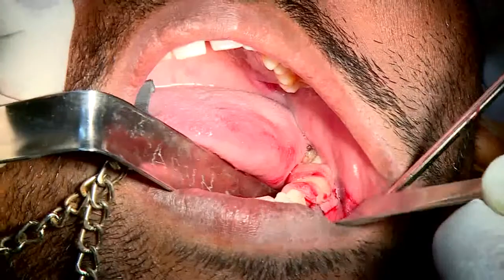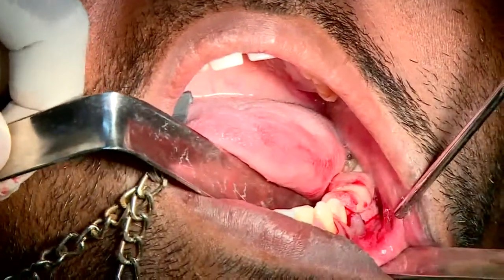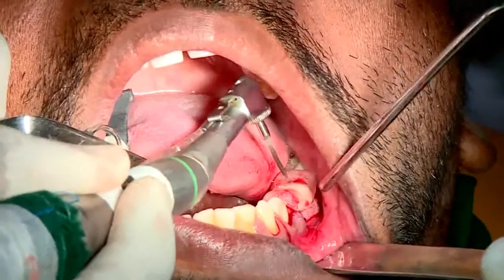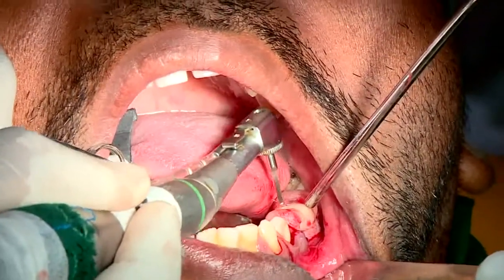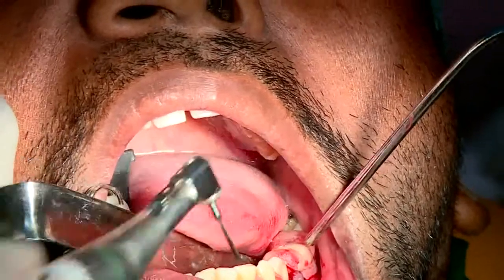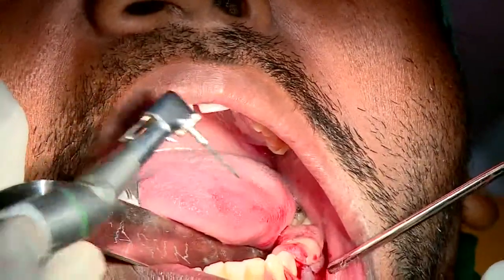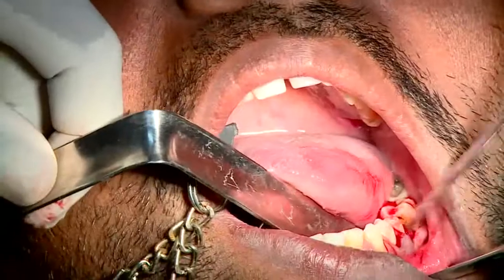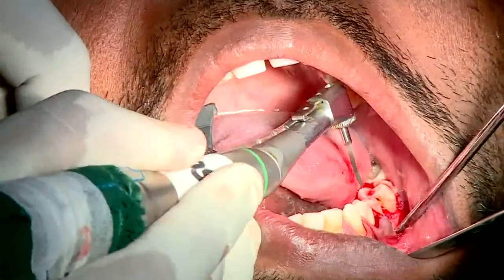Here you can see that this particular splint is sitting there on the tooth. On either side there is a tooth, and all we are going to do is mark the site of the implant. That's it. So this drill, when I start pressing it, at the moment I am just going to take it for a minute for you to just see it. I am not going to drill, I am just going to show them.